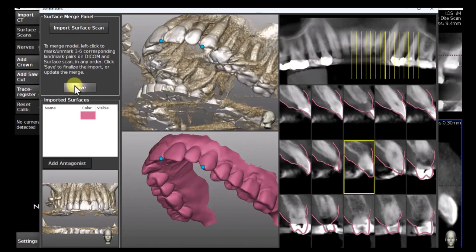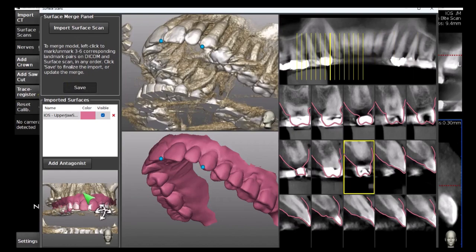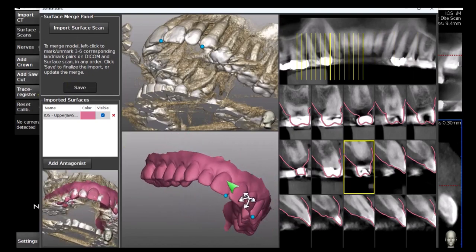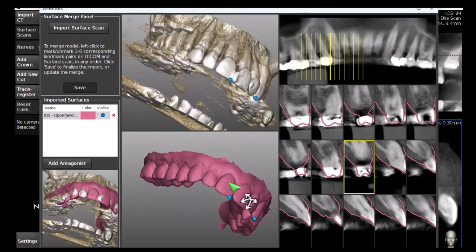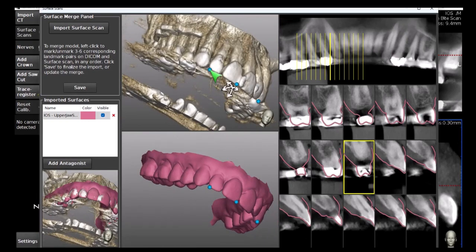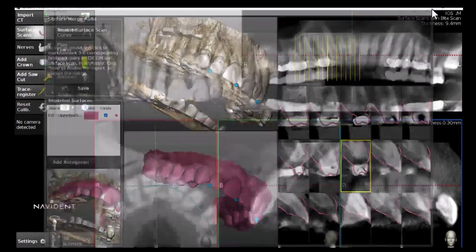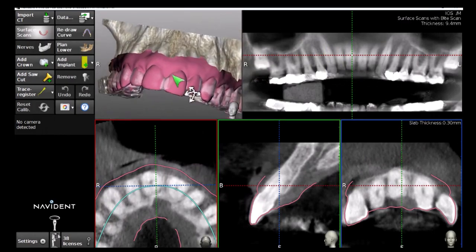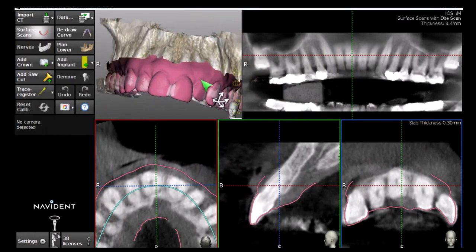The merged result can now be inspected in a 3D view, and matching pair points can still be added or deleted to improve the merging accuracy. When a satisfying result has been achieved, click Save and exit the form. The merged surface scan is now visible in the editing views in Avident's main screen.